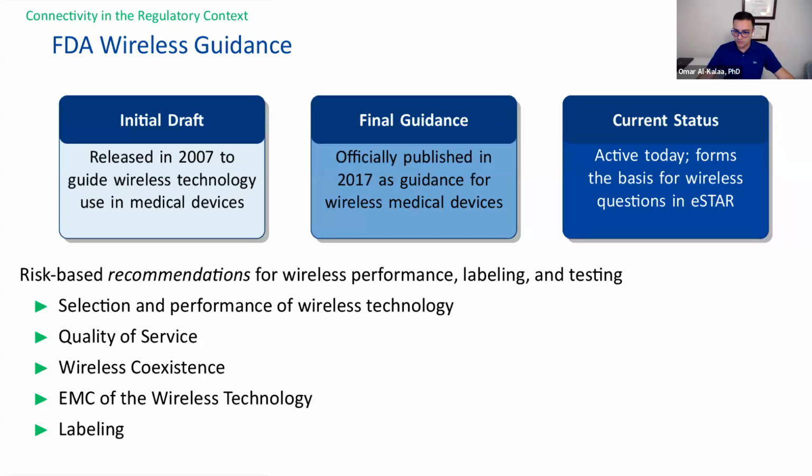If you want to stream high definition video, probably Bluetooth is not your best option. If you want to conserve battery and you only have needs for transmitting data infrequently, then Bluetooth makes a lot of sense. So somewhere in between the different connectivity modalities, you should be thinking about which one is best fit for purpose and how you're going to communicate that selection process to the FDA. The topic of quality of service is also addressed at length in the guidance. I have a slide coming up on that. Wireless coexistence, EMC, or the electromagnetic compatibility of the wireless technology. And finally, there are labeling recommendations that are outlined in the guidance.